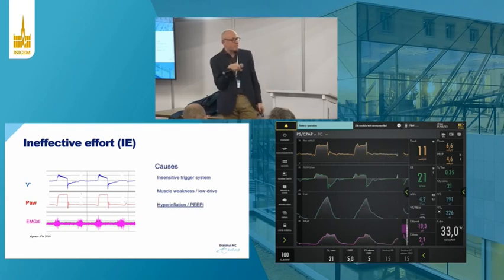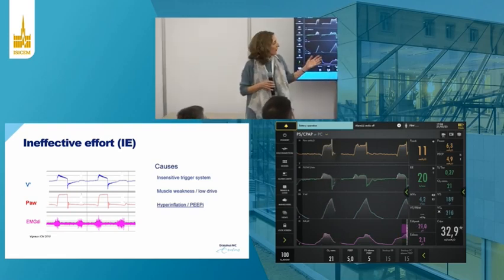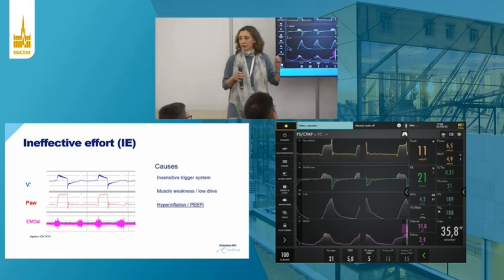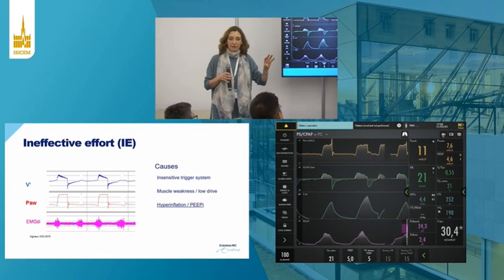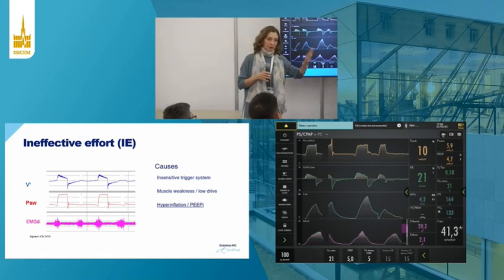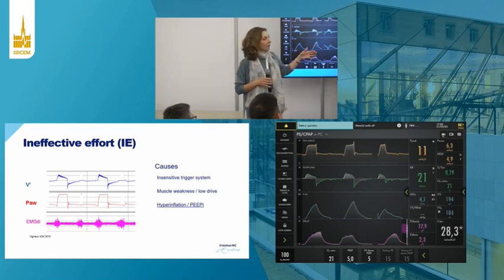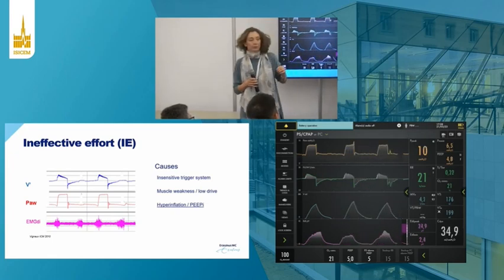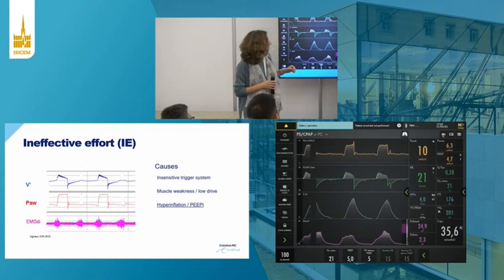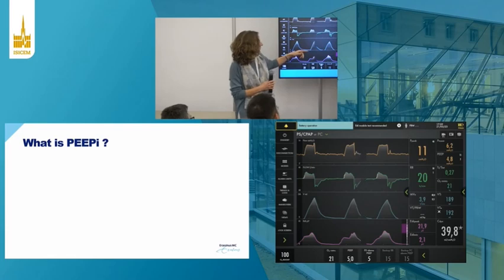So want to take over for now? Sure. So what do you think, when you have an ineffective effort, you have actually an effort that is not strong enough to trigger the ventilator. That means it is not strong at all or not enough. And enough means, if we can have the next slide. Yes, because you're going to show it nicely.